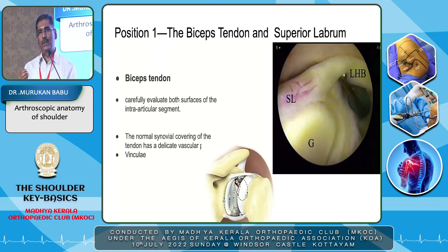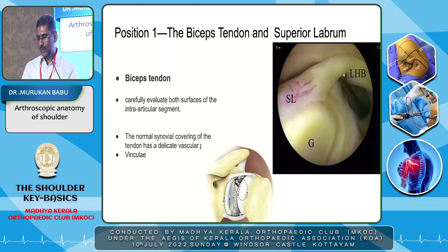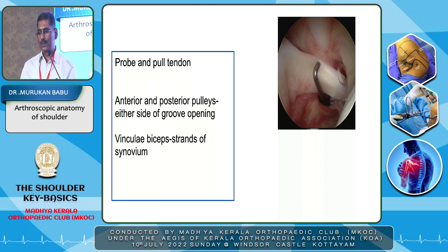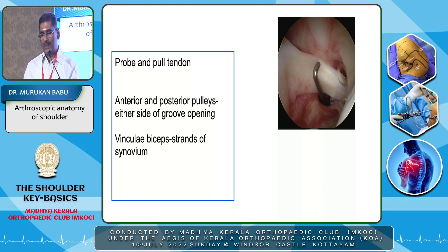From our initial days, if we were seeing the biceps tendon around, we were very happy — but this is the first landmark you need to identify. First, carefully evaluate the long head of the biceps tendon and see the anterior and posterior structures of the intra-articular segment. Sometimes you may see a synovial covering of the tendon — that is the delicate vascular structure called the vinculum. Then probe the tendon to see any fraying or detachment, and see the pulleys on the exit of the groove. You can see the anterior and posterior pulleys of the biceps tendon when you pull the tendon. The vinculum biceps are the strands of synovium.